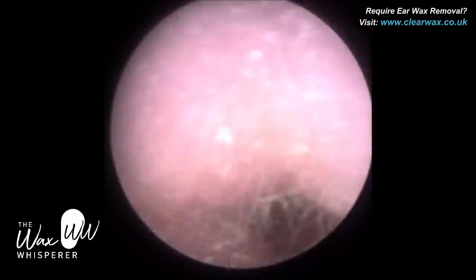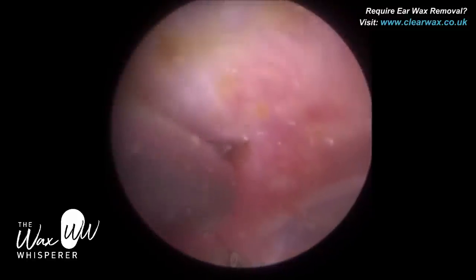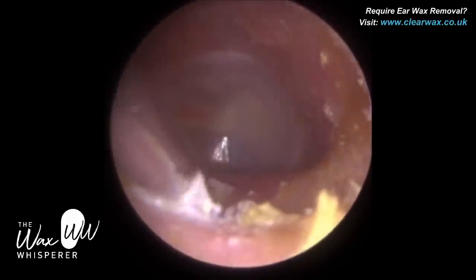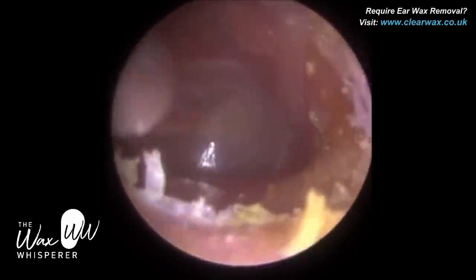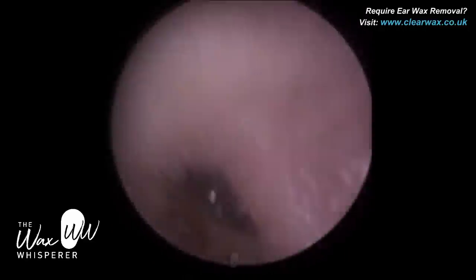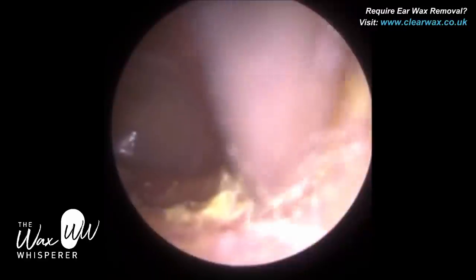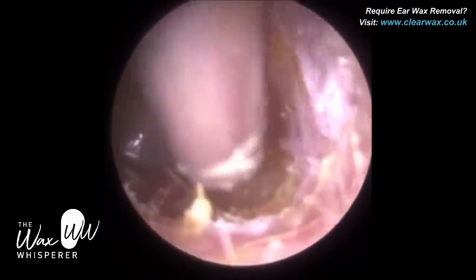Ear irrigation and ear syringing have key limitations. It's a blind technique, so you can't really see what you're doing in the ear canal. Water — even if sterile — can stimulate bacteria that naturally lives in the ear and cause ear infections. We call that otitis externa. The data suggests around 5% of irrigations in the UK have some complications, most typically otitis externa. Ear irrigation also has the possibility of perforating the eardrum because of the pressure, and I've had accounts from nurses and other practitioners who have had perforations occur.